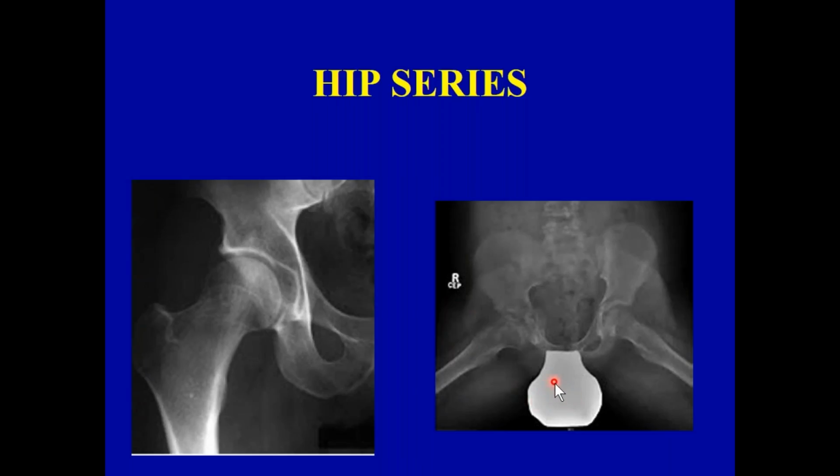It can be done on the lateral as well as the AP view, because this is where the reproductive structures are on the AP view. It in no way will interfere with the examination of the hip. So I've always maintained, I teach, which is worse: not to have gonadal shielding, or to have gonadal shielding sitting in the corner and not to use it.